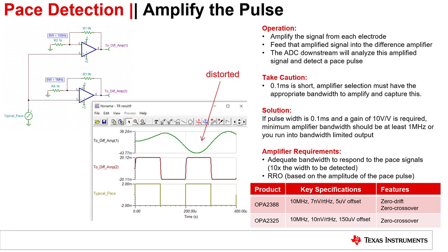For a linear amplifier, we recommend the OPA2325, which offers 10 megahertz of bandwidth. Here is the full circuit showing all of the stages and recommended precision amplifier devices.